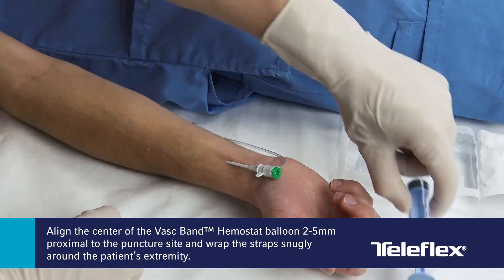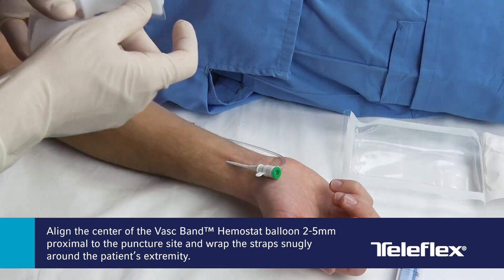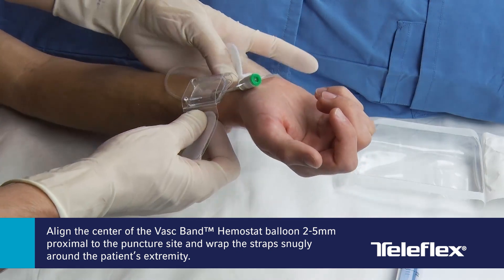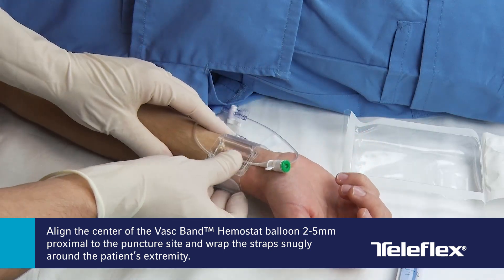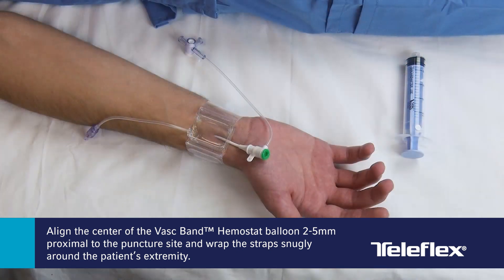Align the center of the VASC-Band balloon 2–5 mm proximal to the puncture site and wrap the VASC-Band straps around the patient's extremity. Secure the device using the hook and loop fastener, allowing no room for slack, but do not over-tighten the band.